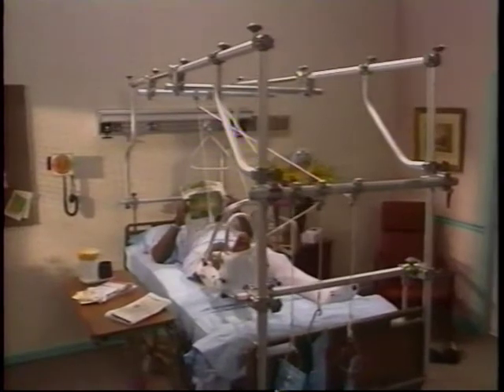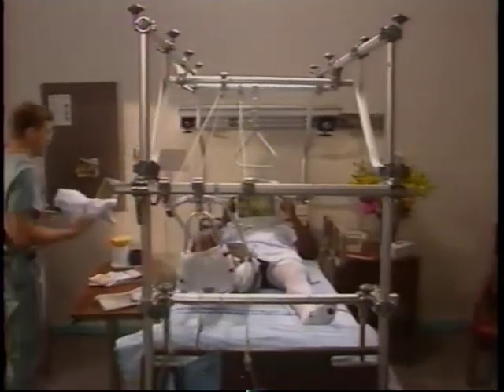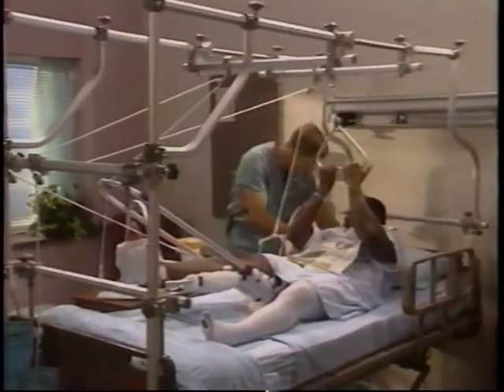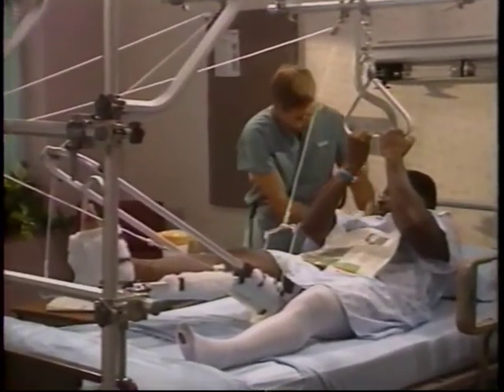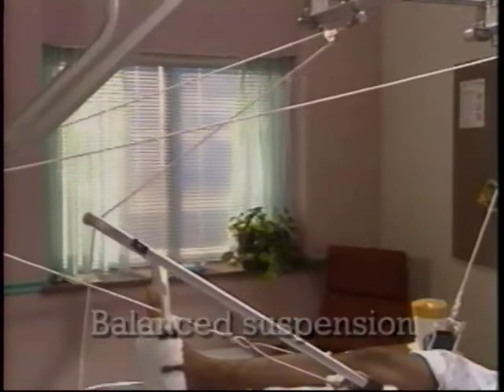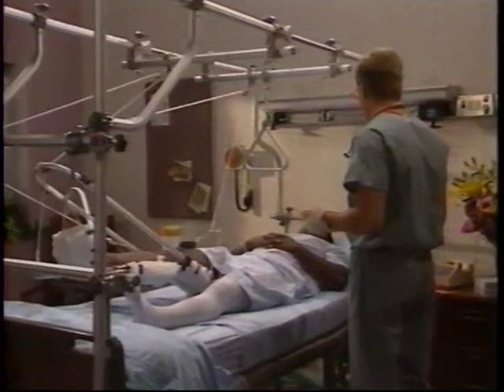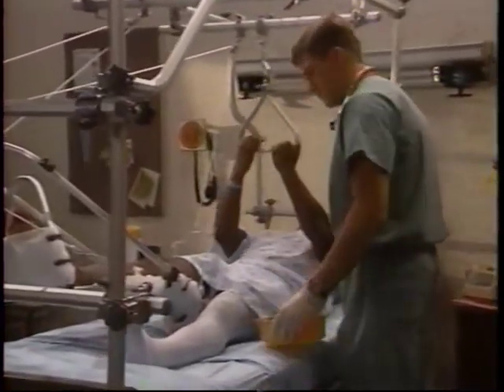In some cases, an injury will require a long period of healing, during which time the injured area must be supported and immobilized to maintain proper bone alignment and growth. Your patient's continued physical and emotional health may greatly depend on his ability to move about as much as possible during this period, which could last from several weeks to several months. Balance suspension, used along with traction, allows for this type of movement. A system of weights and pulleys allows the injured limb to float over the bed in an elevated position. This facilitates using a bedpan, changing bed linens, and allows patient movement and exercise with minimal disturbance to the fracture or joint.